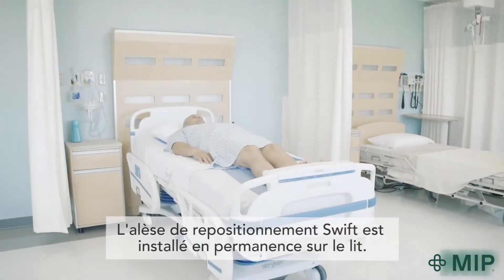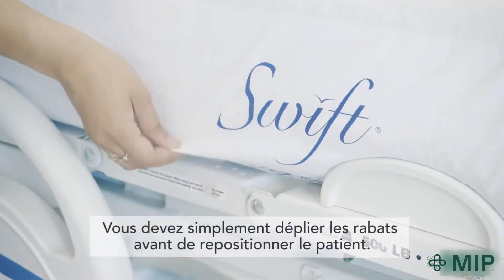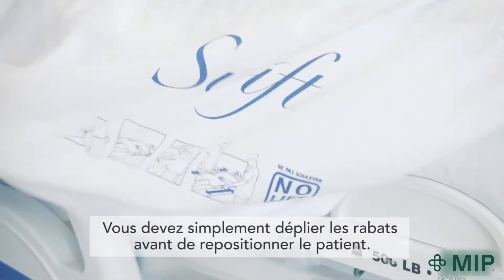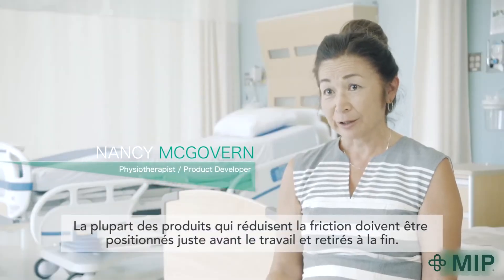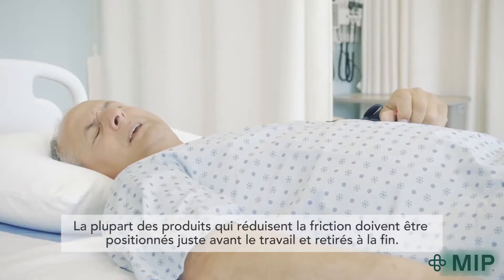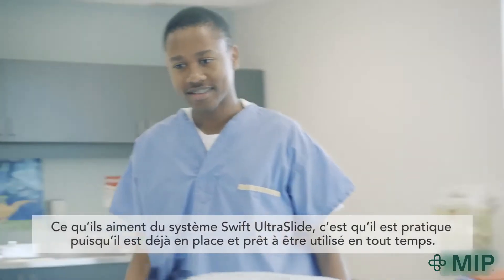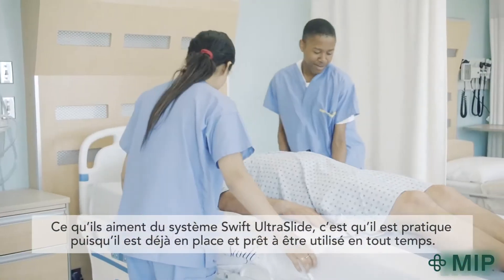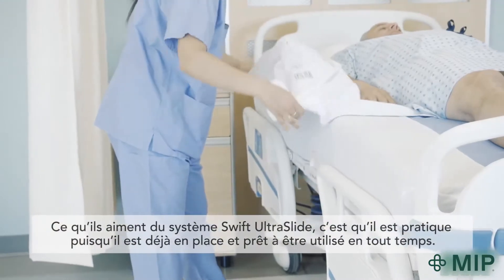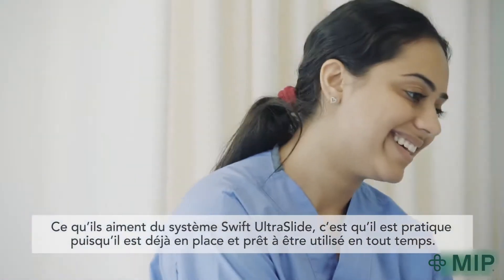The Swift slider conveniently stays on the bed at all times. You simply untuck the flaps when it's time for repositioning. Most friction reducing products have to be inserted before the move and then removed following the move. Nurses have multiple demands on their time every day. What they like about the Swift Ultraslide system is that it's convenient because it's already on the bed, ready for them to use at any given time.